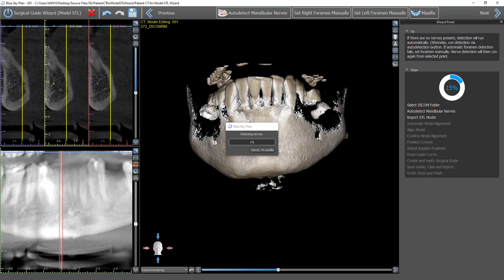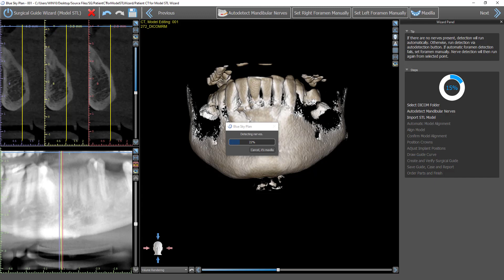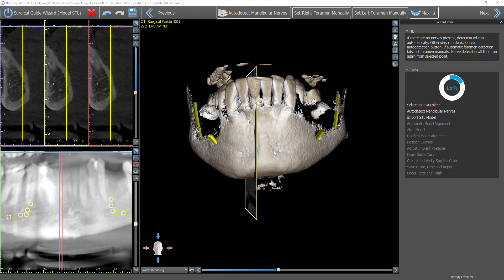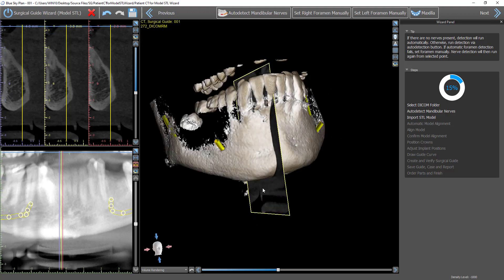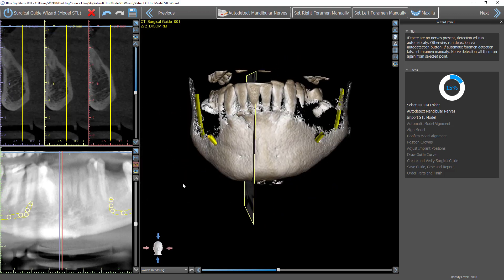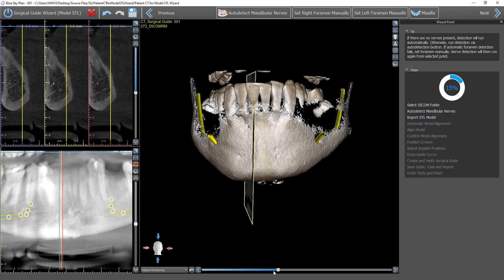And we're going to watch what happens here. Right away, as we're importing the DICOMs, the software is running automatic nerve detection. If it's a maxilla, we could just click cancel to maxilla. But in our case, obviously, it's a mandible.